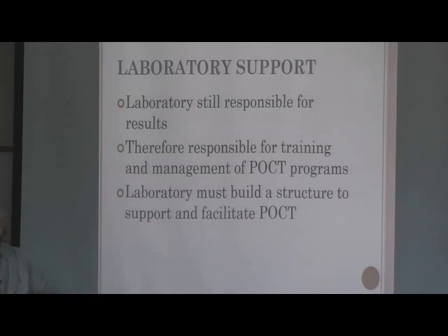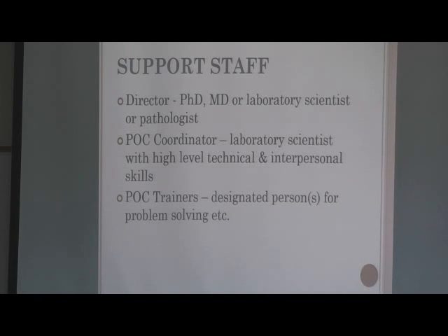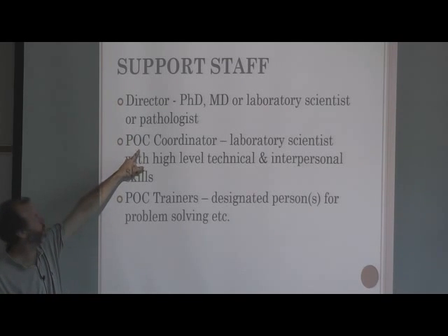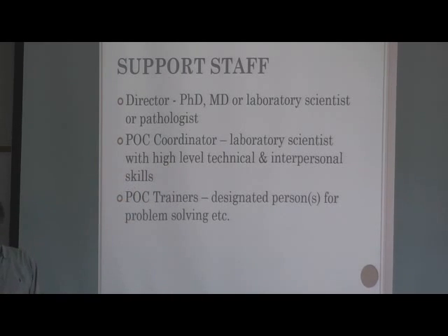You must build a structure to support and facilitate the point-of-care testing. So you're going to have a director, and a laboratory director has to have a PhD or MD, laboratory scientist or a pathologist, and a point-of-care coordinator, which can be a laboratory scientist with a high level of technical and interpersonal skills, right? You've got to have those interpersonal skills because you have to interact with all the physicians and everybody that you have to train. And the point-of-care trainers can be any designated person, for problem solving, etc.